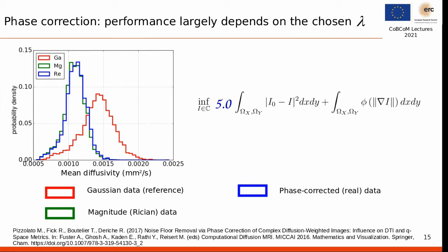And in this case, it corresponds to a regularization of 5 that is indicated there in the equation. And I want to show you how this number, especially by decreasing it, is going to change the distribution of the blue histogram indeed, and going to overlap on top of the red one. So indeed, that's what is happening. And we can slowly actually approach the reference target distribution.